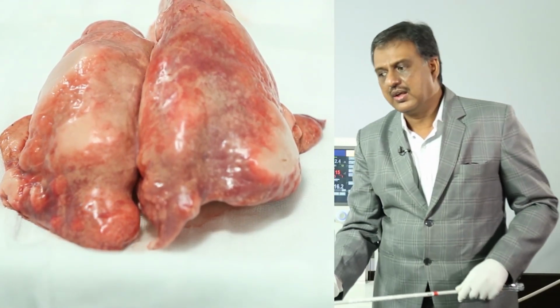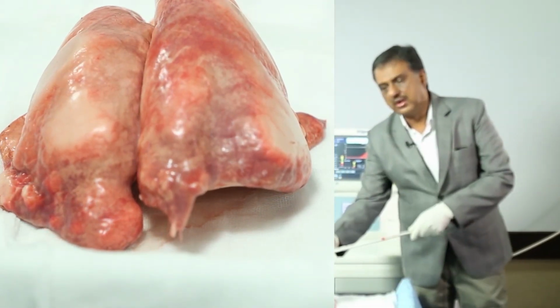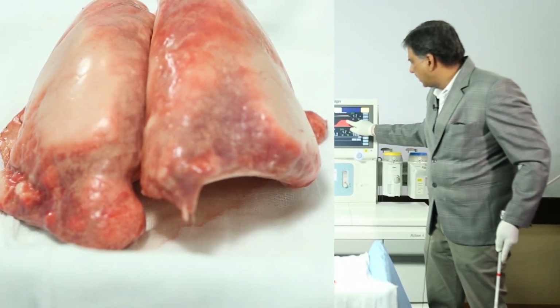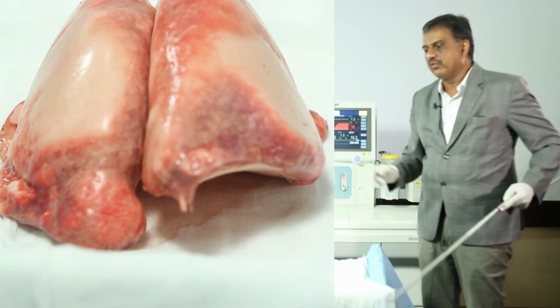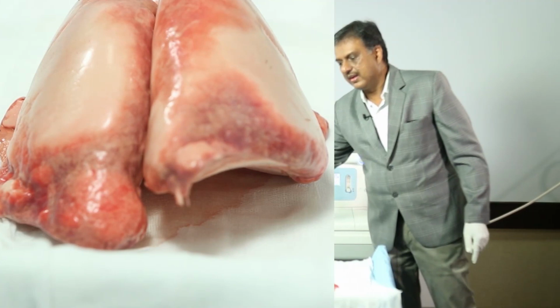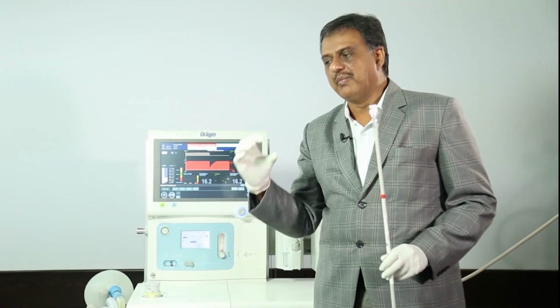Gradually 40 centimeter of H2O pressure is going to build up in the lung, and once it reaches 40 centimeter of H2O, keep it for 8 to 15 seconds. This will open all the atelectatic areas. This is called the vital capacity maneuver.